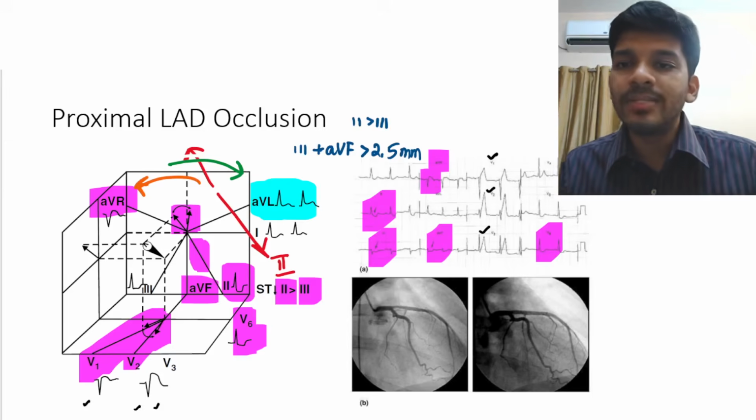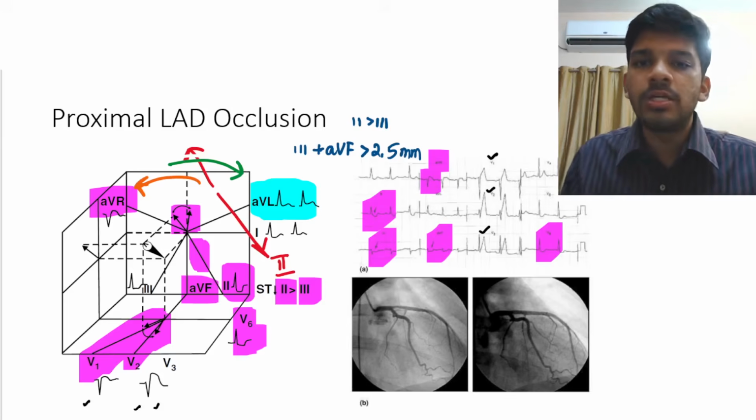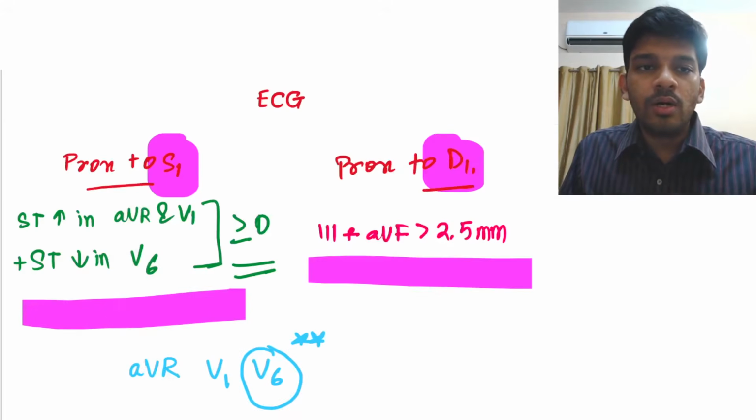Anyway, that is not relevant to us at the postgraduate level. So that is how the pre and post coronary angiographs look like. Now, we'll go more quickly through the remaining occlusions. So if you will just allow me to give you a schematic understanding of how we shall be proceeding.